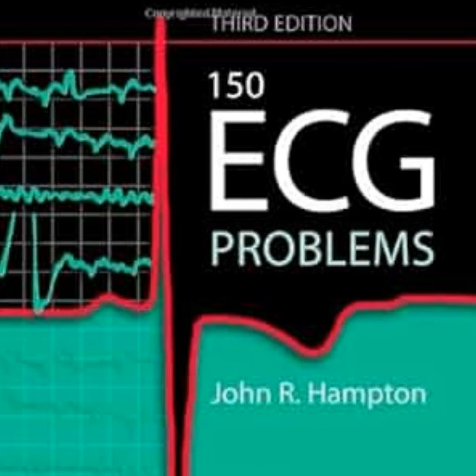Spot on. So you hold the patient, you initiate your acute coronary syndrome protocols, and you check those plasma troponin levels to look for biochemical evidence of myocardial necrosis. It is a perfect application of clinical context overriding misleading electrical data. Recognizing the limitations of the tool is honestly just as important as knowing how to actually read the tracing.